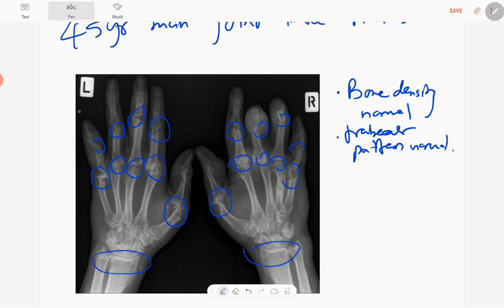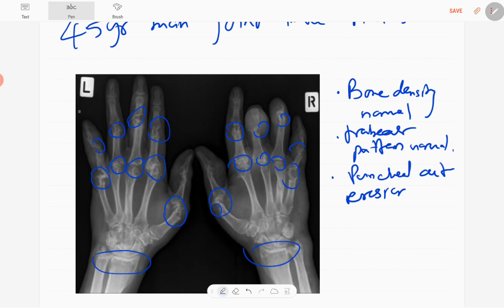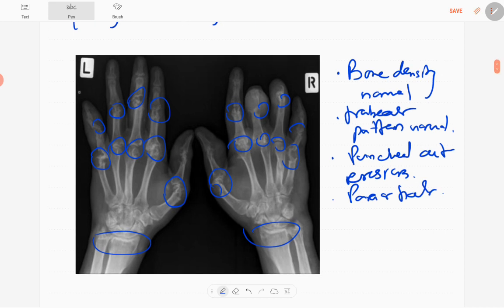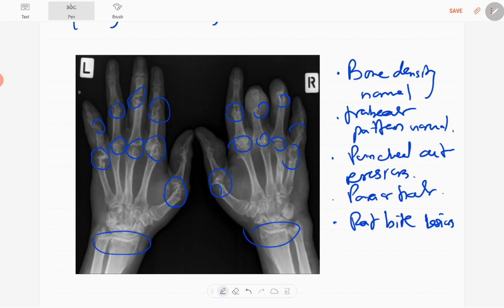Here you can see punch-out type erosions. These punch-out type erosions are juxta-articular or para-articular — sometimes called rat-bite lesions. However, there is no periarticular osteopenia.